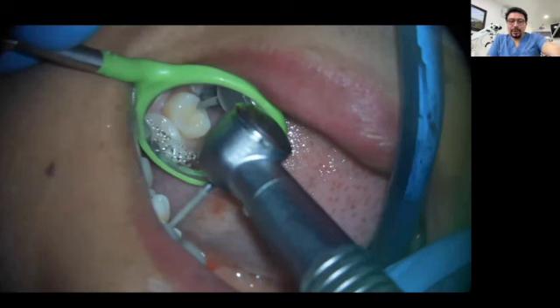One important thing when you are working under the help of the microscope is to learn where to position the mirror. One big mistake is trying to position the mirror in the same way you used to position the mirror when working without a microscope. When you are working with a microscope, you need to place the mirror as far as possible from the working area. And a useful point of reference might be the opposite lip of the area in which you are working.